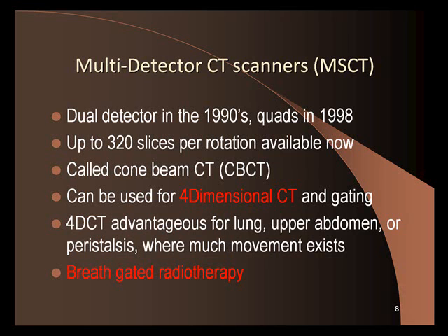So 4D CT is advantageous for lung, upper abdomen, or peristalsis, where much movement exists. And then this will lead into breath-gated radiotherapy. And I'll talk about that in a couple of slides. Okay, does that time component make sense? Okay.